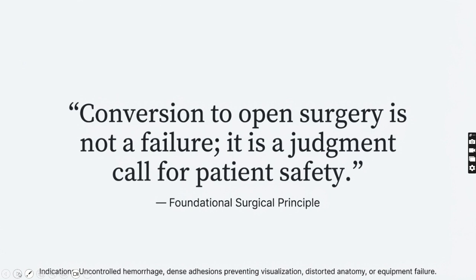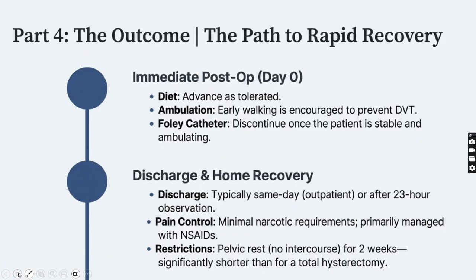Conversion to open surgery isn't a failure, it is a judgment call for patient safety. Laparoscopic subtotal hysterectomy promotes a rapid recovery. Patients are often discharged on the same day, and it requires minimal analgesics and has shorter restrictions, such as only 2 weeks of pelvic rest and avoiding intercourse.